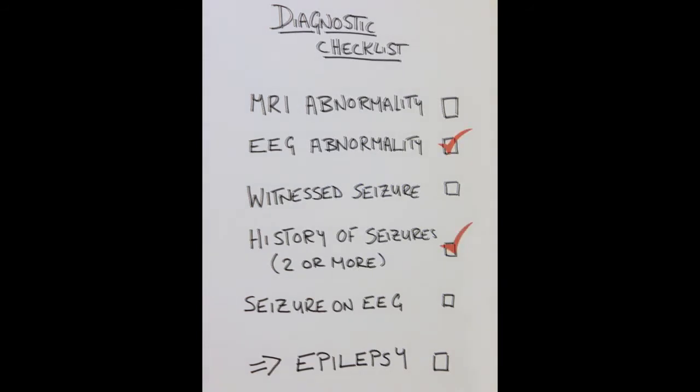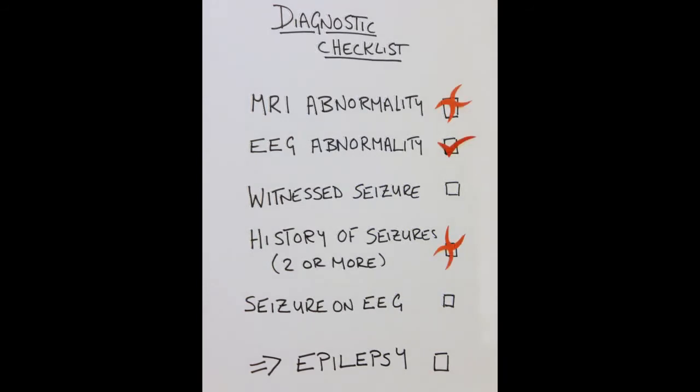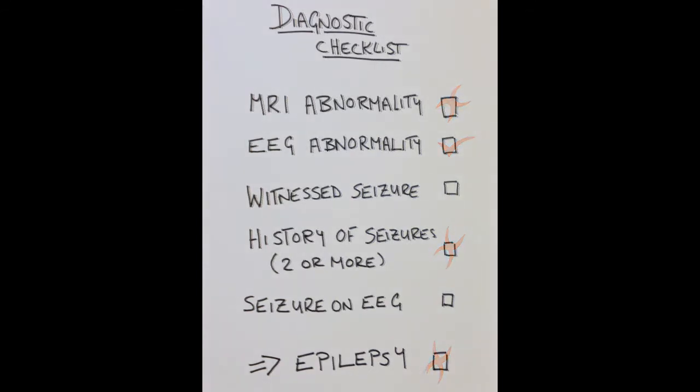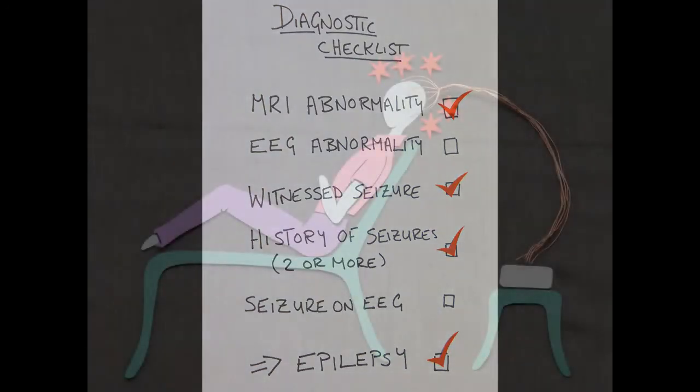If we see abnormalities on an EEG, that would often serve to very strongly reinforce the diagnosis that may have been made from history already. We wouldn't make the diagnosis on the EEG alone. There are some people who don't have epilepsy, will never have epilepsy, who have similar abnormalities on their EEG. So it's not an absolutely black or white diagnostic test. But if there's a good history, then an EEG is an extremely important confirmation of the type of epilepsy and where in the brain it's coming from. So it's important in that regard.